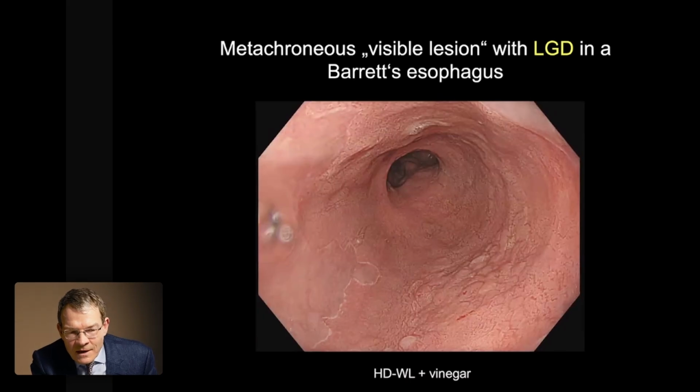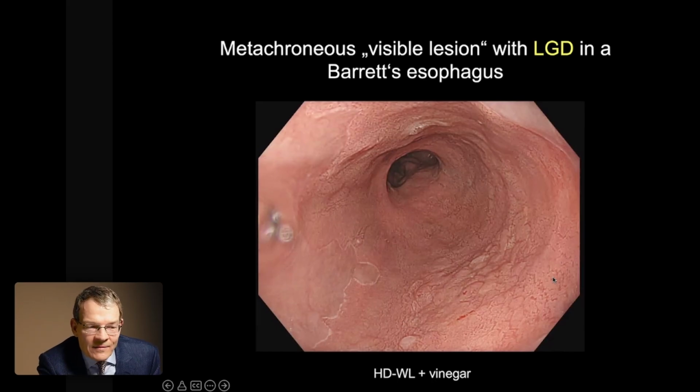But now I put vinegar, and you nicely appreciate that you can see the structural abnormalities quite a bit better than with TXI or NBI.